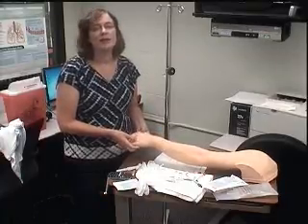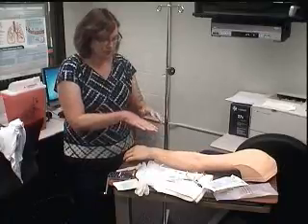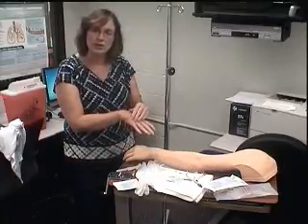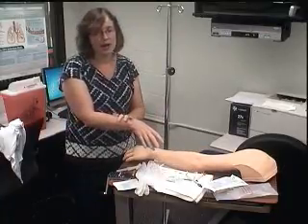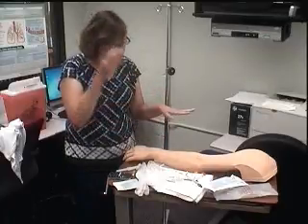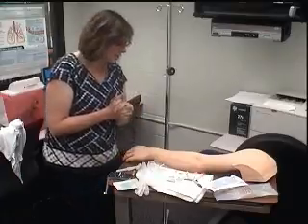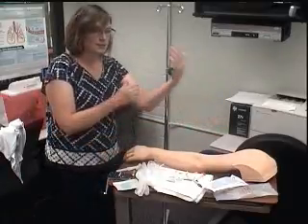I also would be thinking about their age when I go to put in a line. Maybe if they're a really frail, thin, old person, I might not want to use their hand. Maybe I want to go up a little higher. Of course, with babies, you have to think about where you're going to put it. A lot of times we use their scalp and all that. I know that sounds weird, but we do. Mobility level. I wouldn't necessarily want to put it on the bend.